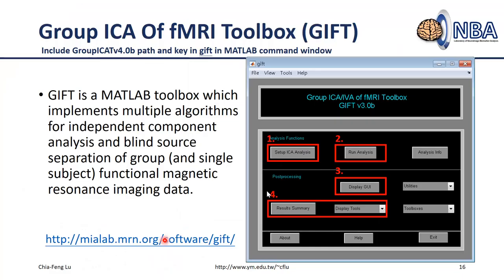This is the main GIFT interface. It includes several different panels. The first is the analysis function panel, which has three buttons: 'Setup ICA Analysis', 'Run Analysis', and 'Display'. For the first button, you set up parameters including file paths, number of components, and which ICA algorithm to use.